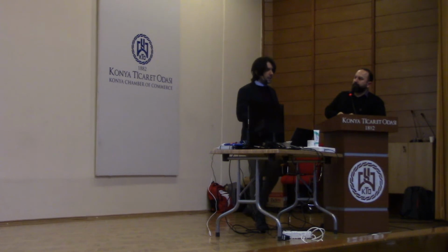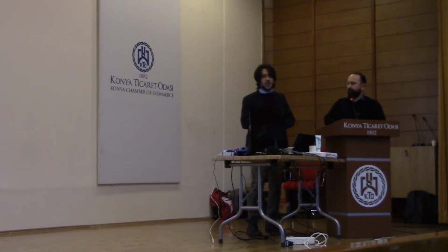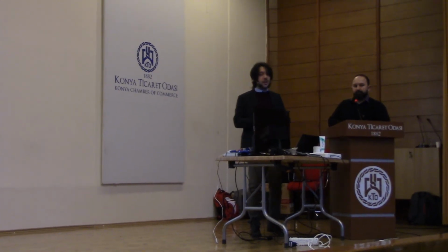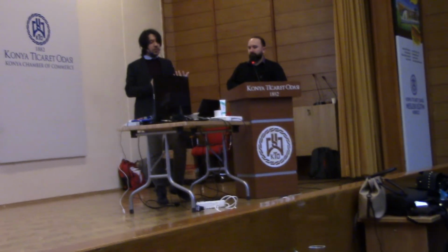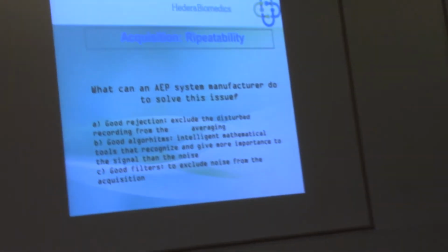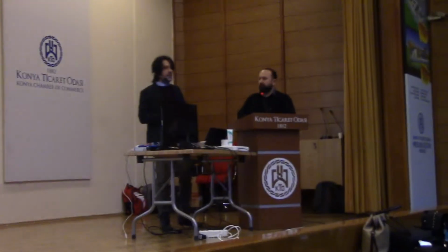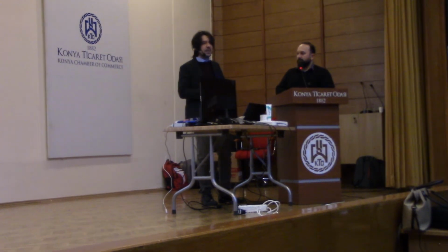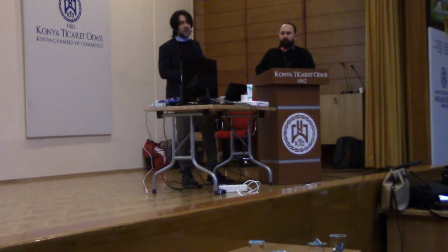So there should be a friendship between developers and clinical operators. A friendship on getting quick results, repeatable at the same time. So a part of the job should be done by the manufacturer, we will see how, and a part should be done by the clinician. If these two things match, you can even do an ABR in a few minutes, get a response.